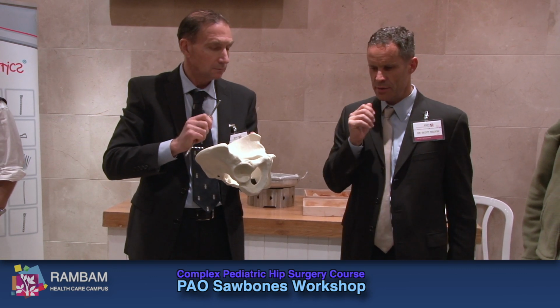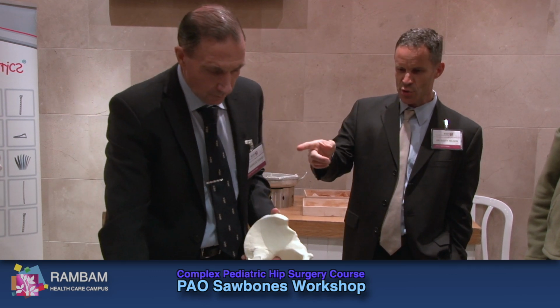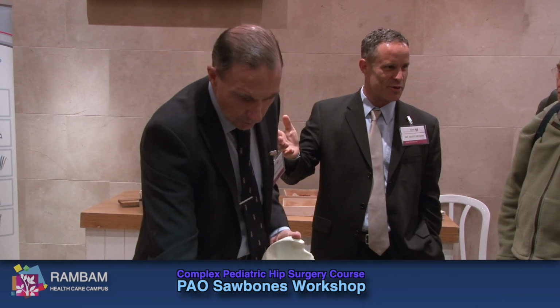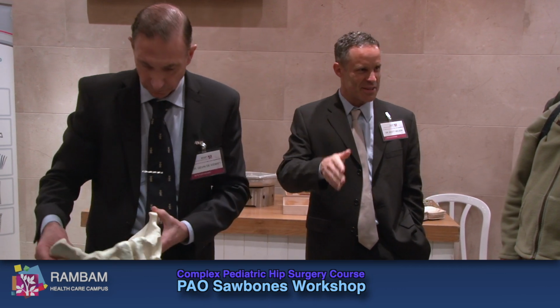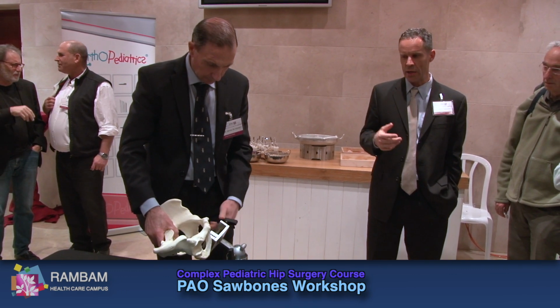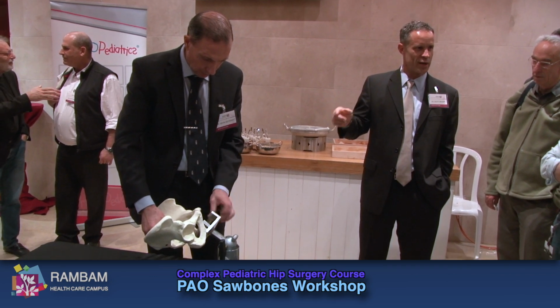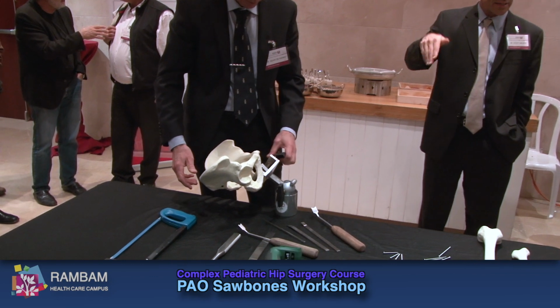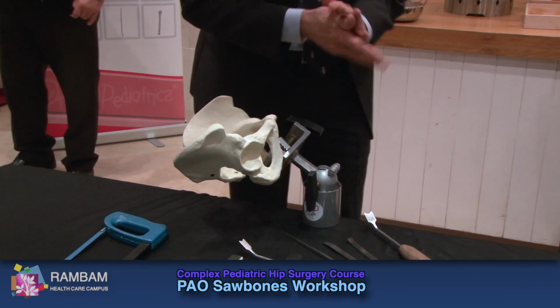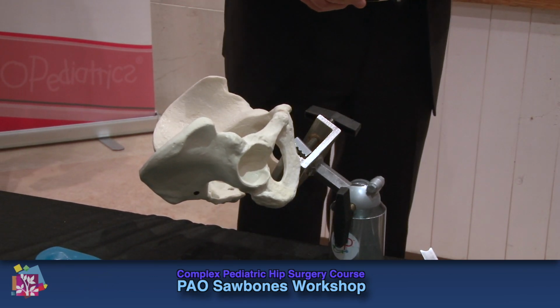But certainly, I think the normal technique is to do the ischial cut first, because just like we like to have our dessert after eating vegetables, you do the ischial cut, and it's the most difficult one. So with that concept in mind, it's a good way to do it. I think once you have experience, it's certainly fine, but it is nice to be able to visualize that osteotome in there when you're doing the posterior column and have both of those to get that corner loose for me, and it doesn't require going back in there and re-cutting that one if you do it in that way.